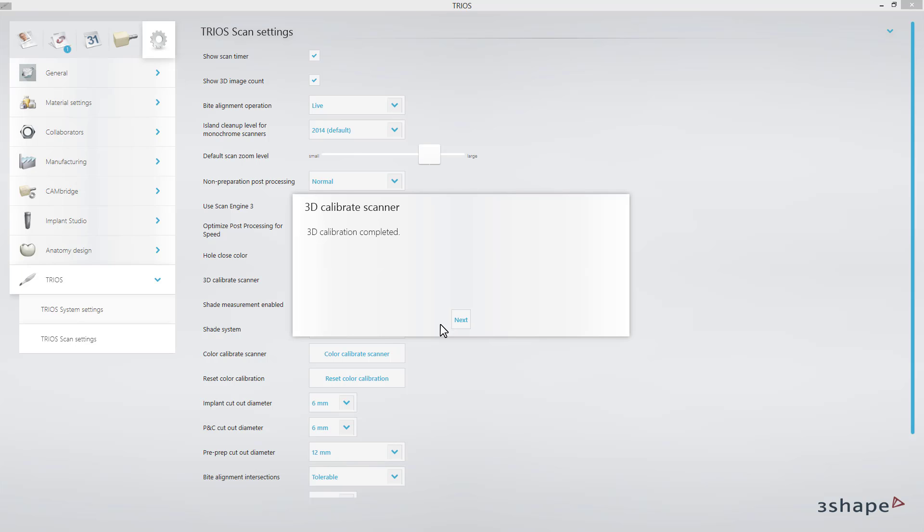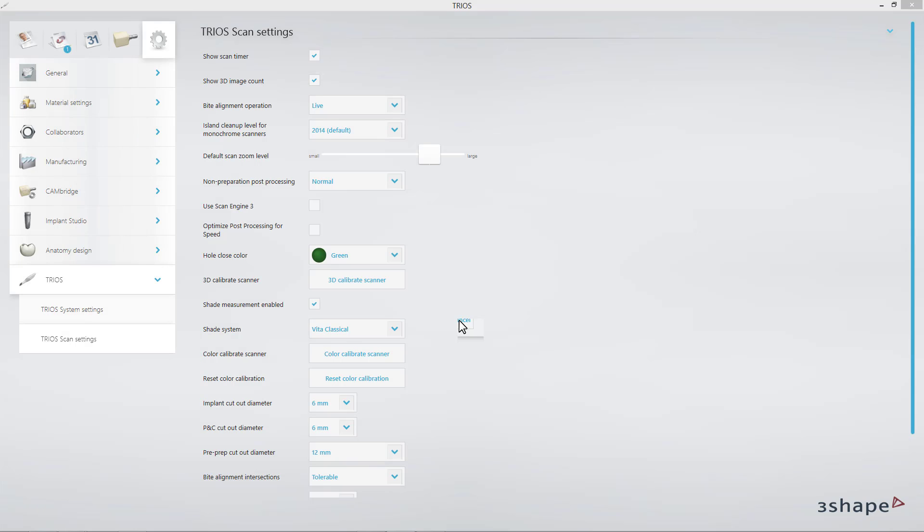When it is finished, remember to remove the 3D calibration tip from the scanner in order to prevent it overheating. As soon as 3D calibration is completed, you can proceed with color calibration.